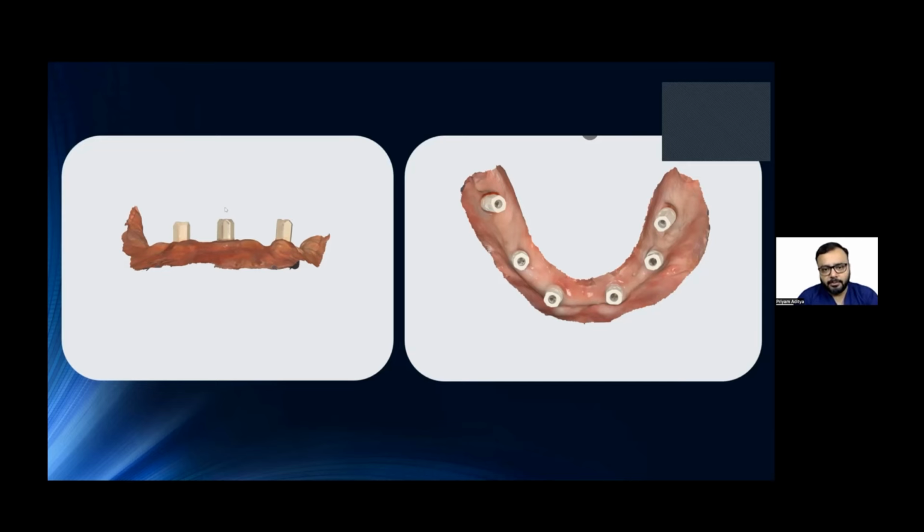We have to use proper light and contrast conditions. Sufficient overlap of scanning images is needed so that the software can stitch the images better. Always calibrate your scanner when the software tells you to. Calibration is very important. The newer scanner, the i900, will not require a calibration every 14 days. So the company has done major developments with the i900, but calibration is very, very important.